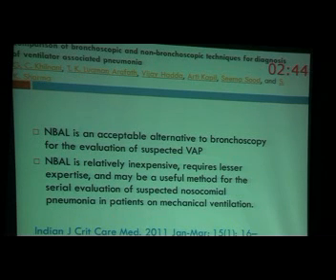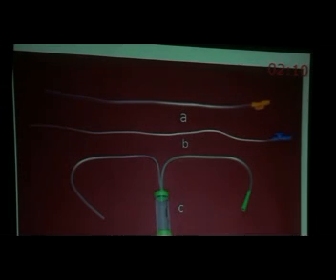وليها ميزه, اول حاجه انها very good acceptable alternative للبرونكوسكوبي. ثاني حاجه انها inexpensive, less need less experience مش جوه الواحد يعرف برونكوسكوب ولا حاجه. وميزتها انها repeatable ممكن اعملها النهارده وبكره وبعده بحيث ان انا افولو العيان دوت قد ايه الاورجانيزم اللي عنده بيتغير او قد ايه السنسيفتي بتاعه بيتغير. ولقوا ان الاثنين very effective وبالتالي في الباب نيمونيا وي كان ريزورت تو نون برونكوسكوبيك برونكال لافاج rather than برونكوسكوبيك برونكو الفيولا لافاج. فكرتها سهله احنا مش هناخد تفاصيلها.